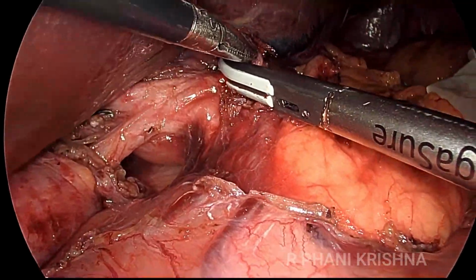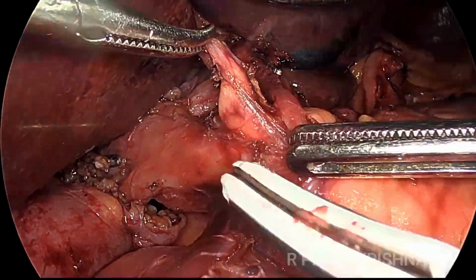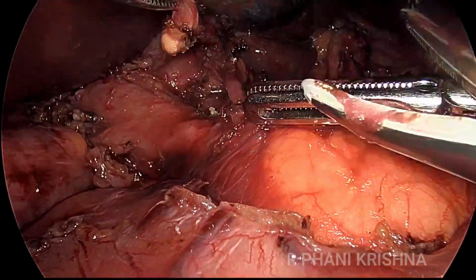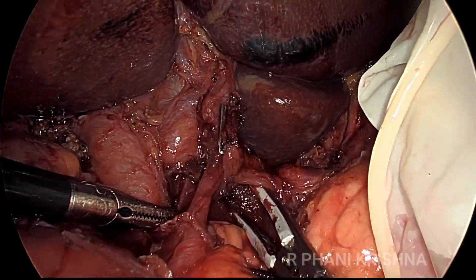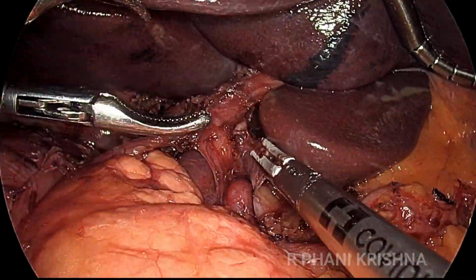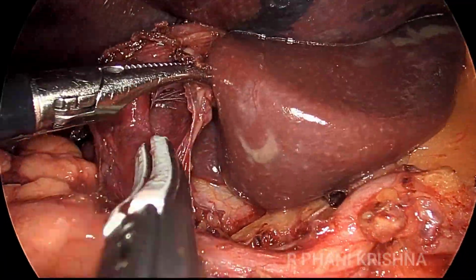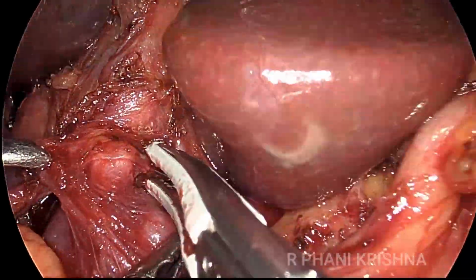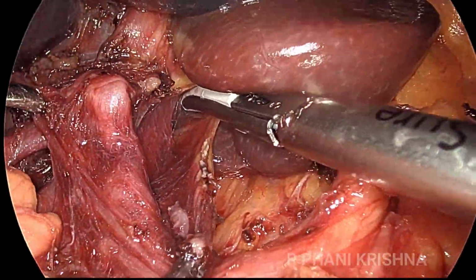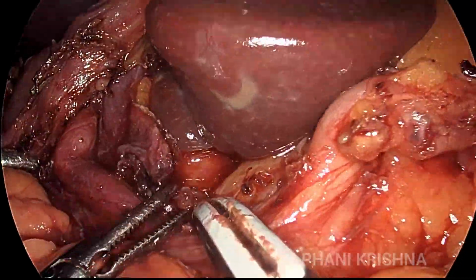So it's just like we're doing here. Just define your structures well before dividing them. There is usually some nodal tissue between the hepatic artery and the bile duct that is cleared. Subsequently, the portal vein is being defined here. And once we define the portal vein, all the fibrofatty lymphatic tissue on the left border of the hepatoduodenal ligament is being cleared till the liver hilum.